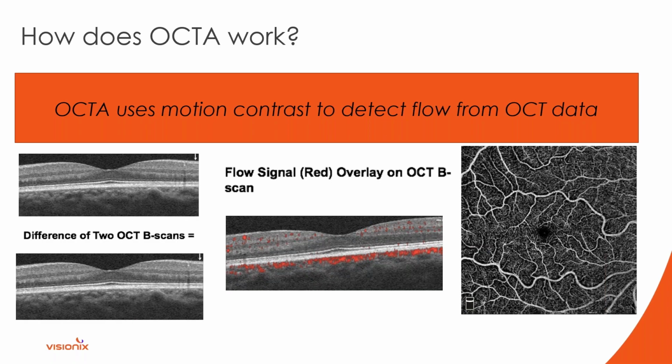So looking at the RPE and noticing little red pieces like this in the RPE, you have to start asking yourself, is that artifact or is there actually an abnormality on the OCT B scan? So this image is quite important and actually a very integral part when you're learning to interpret OCT angiography.